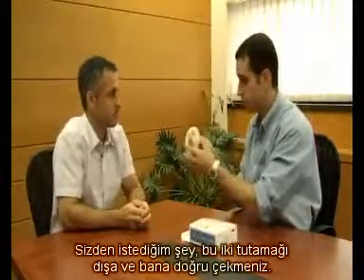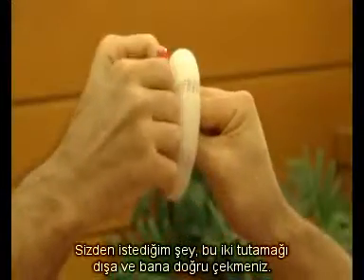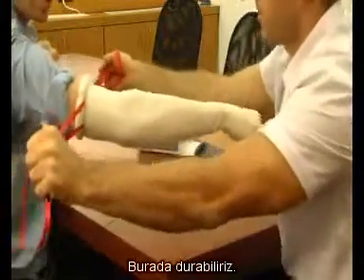What I need from you — this is the Hemaclear — to pull these two handles outside and toward me. Like this? Yes. Wait a minute. You can take it all the way up. Okay, you can stop here.